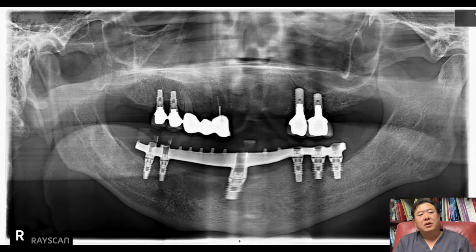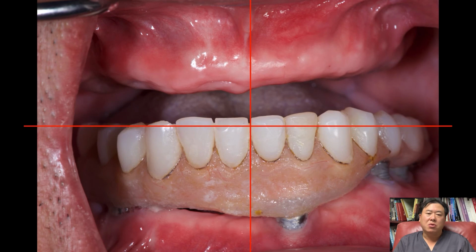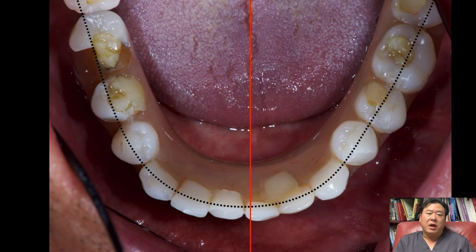This patient had very poor implant treatment, and all of them needed to be removed. Patient showed roller coaster occlusion and severe canting in all XYZ axes were evident, and arch form was very asymmetric. To make matters worse, this patient wanted to start and finish the treatment on the maxilla first. Then he wanted to finish the lower jaw later. This posed a great challenge.